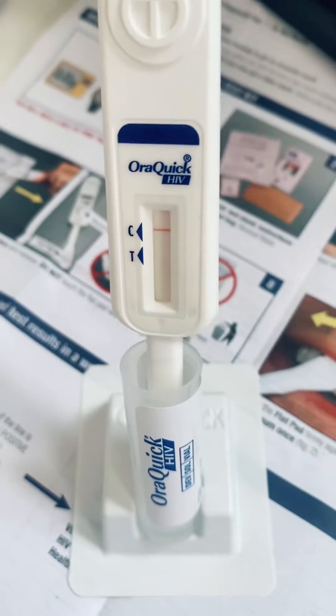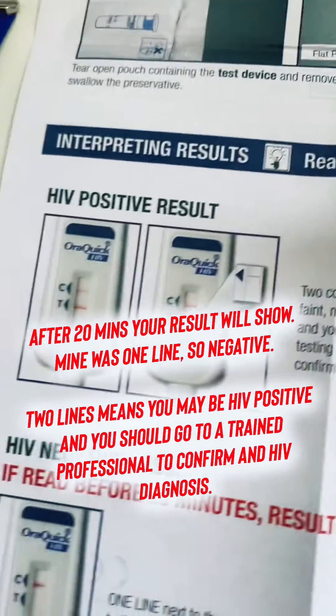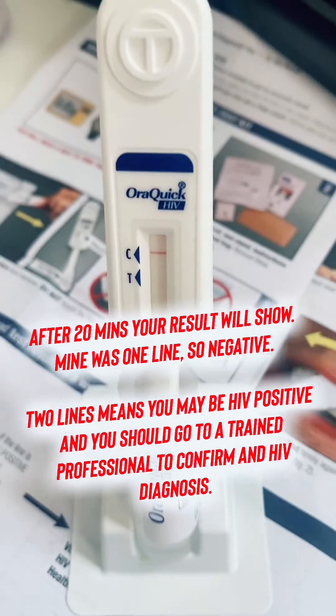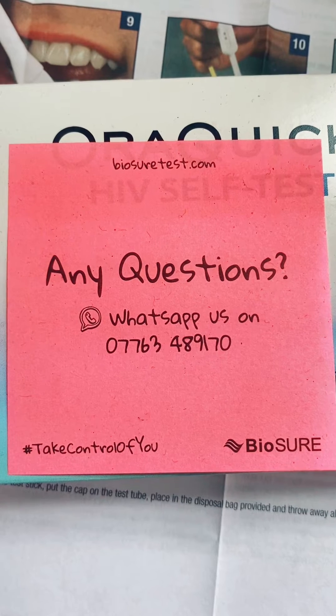This test has a proven accuracy of 99.7%. If you do get two lines or an unreadable result, you should go to a trained medical professional just to confirm any possible HIV diagnosis. If you have any questions, you can contact Biosho directly.